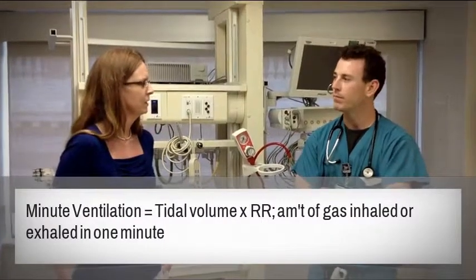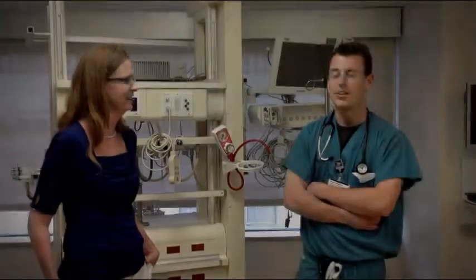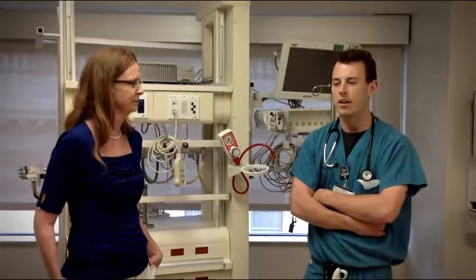And what is minute ventilation? What does that mean? So minute ventilation is how much air the patient's moving in and out in a minute. A good easy calculation to use is the respiratory rate times the tidal volume. And the ventilator usually automatically calculates the minute ventilation. A normal minute ventilation is 6 liters a minute.